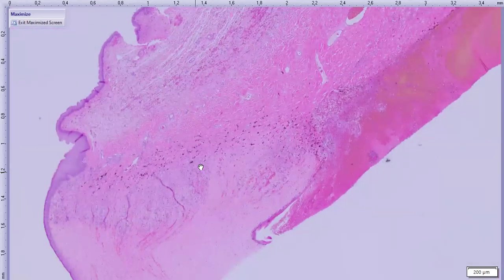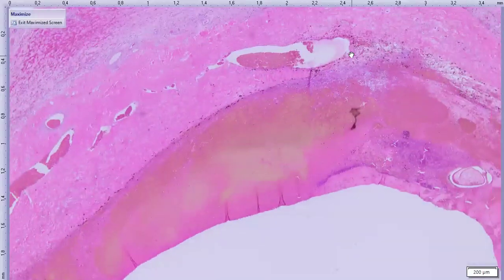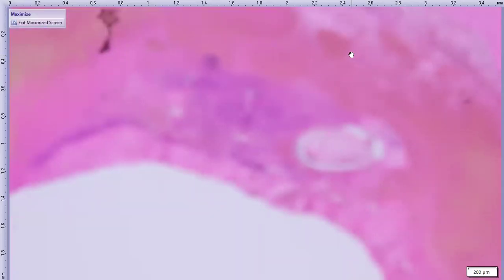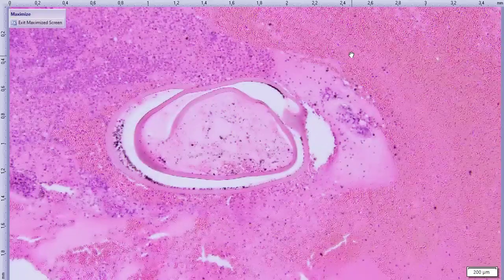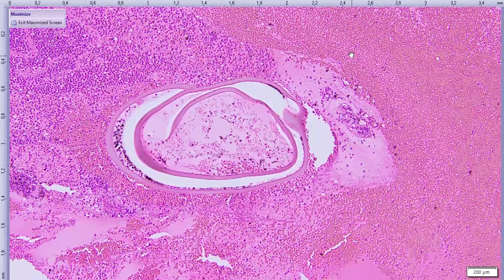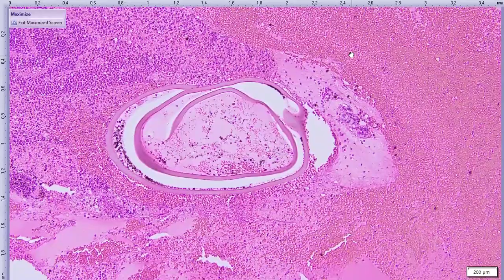where there's the limbus. We can do this at lower power here. And so here's sclera, and once again, we should have some anterior uvea that's attached, and instead we don't. There's no sclera, there's no uveal tissue attached here. This is a little bit curled up segment of Descemet's membrane, presumably, which has been torn away from the posterior corneal surface.